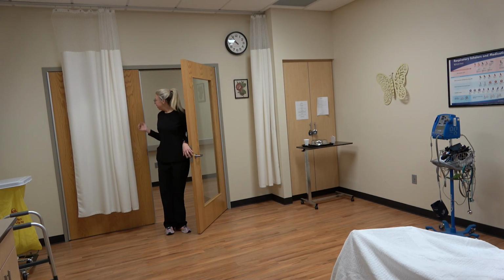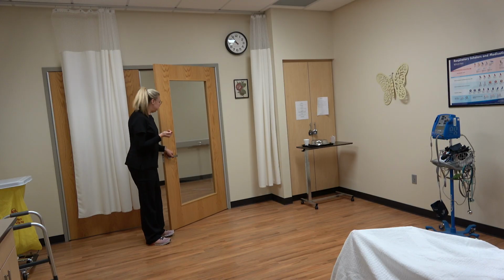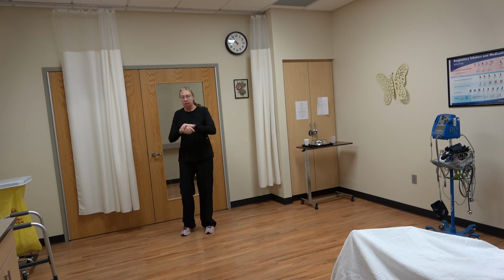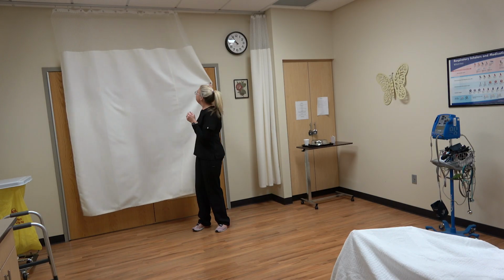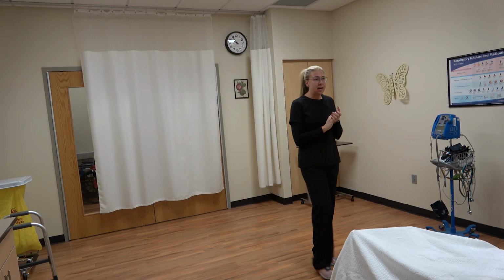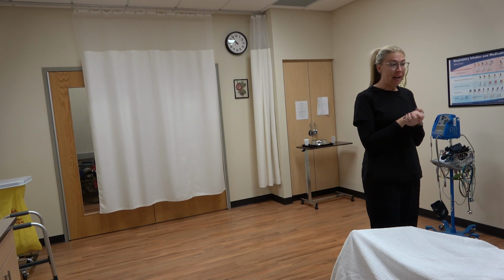Hi, Mr. Smith. My name's Danny. I'm going to be your nurse for today. So I got some foam. I'm going to do hand hygiene. I'm going to go ahead and provide for patient privacy. I have a medication for you today. I have some pain medication.